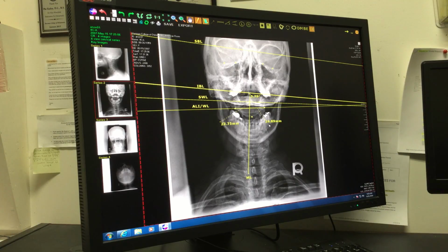We can also note that the wedge is closing between the superior wedge line and the atlas inferior wedge line. So this also tells us the side of the closing wedge indicates the side of atlas laterality. So method 1 and method 2 for determining atlas laterality are in agreement with each other, and that's always nice because it doesn't always happen.